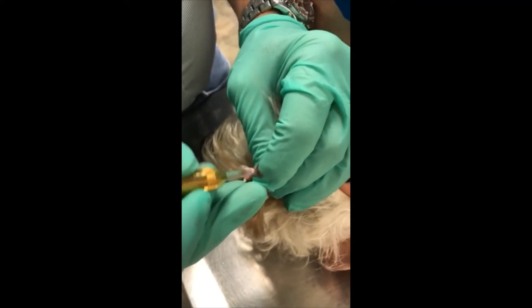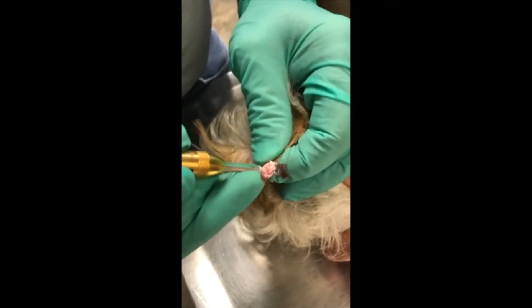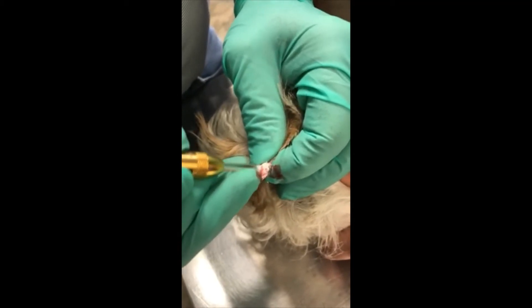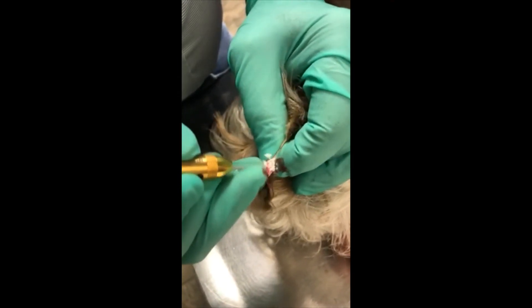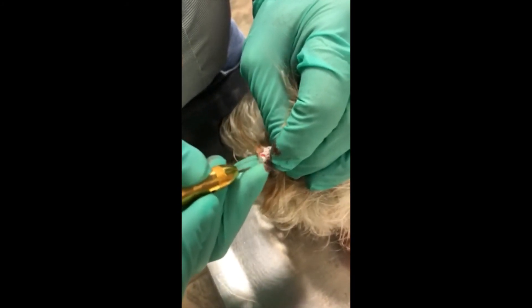Because this is on an ear margin and centrifugal force tends to cause them to bleed, I have recommended that clients either use an Elizabethan collar — which the dogs hate — or alternatively a knee sock inverted over the head to keep the ear that's been treated flat against the cranium.